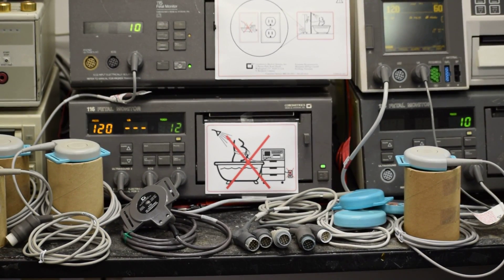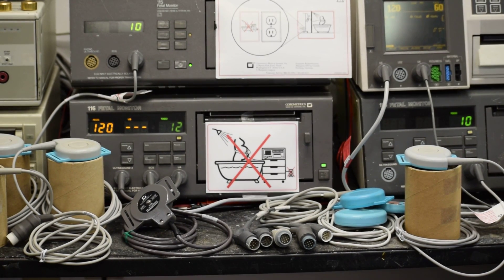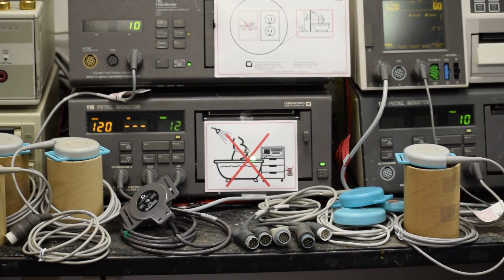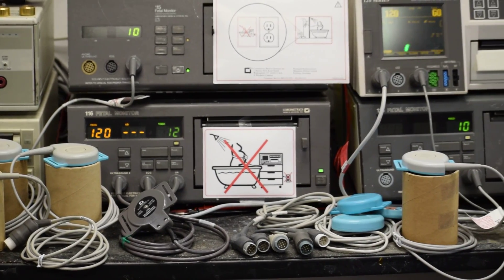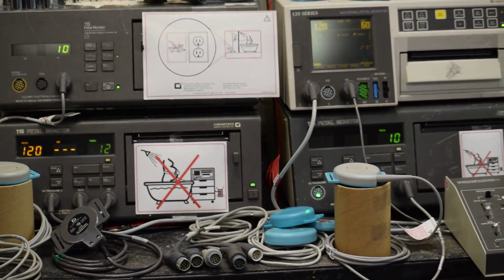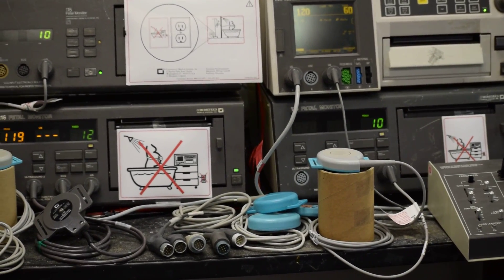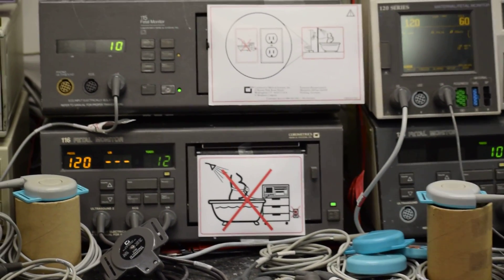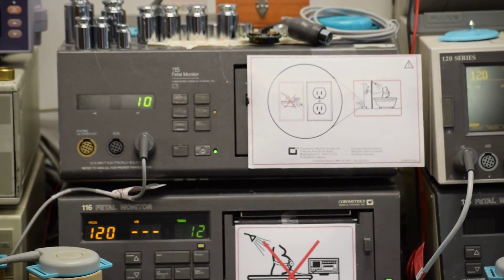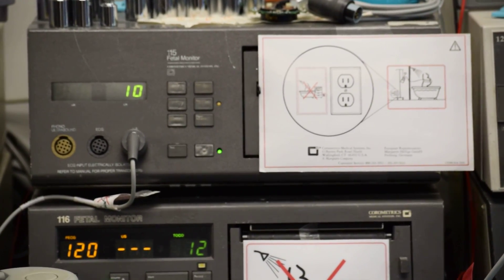Seen here are the Corometrics fetal monitors model 115, 116 in the center at the bottom, 120 series, and there's one more 116 monitor. The 115 model is very old, completely phased out. GE doesn't manufacture it anymore.